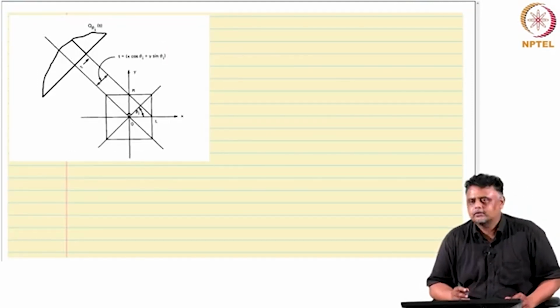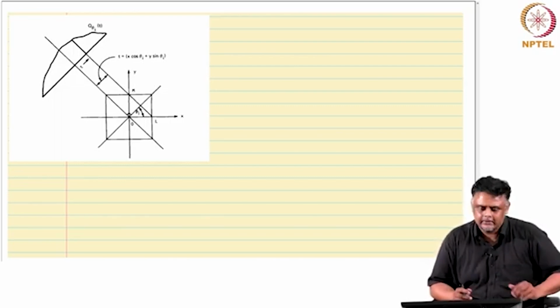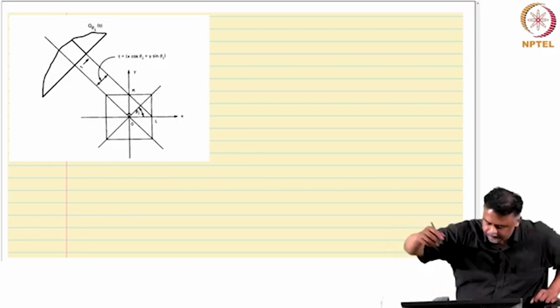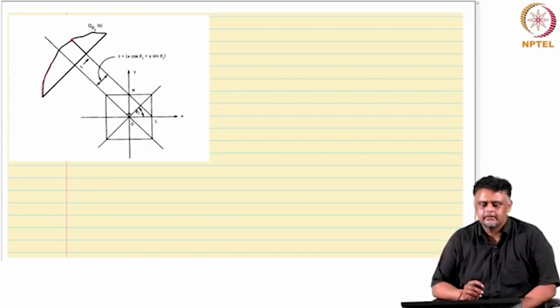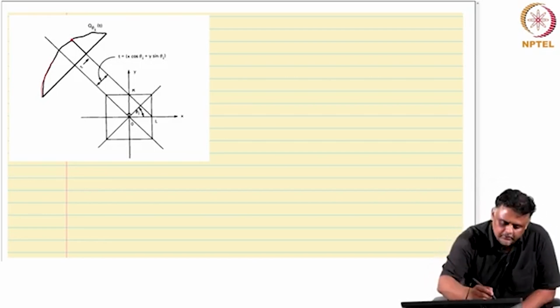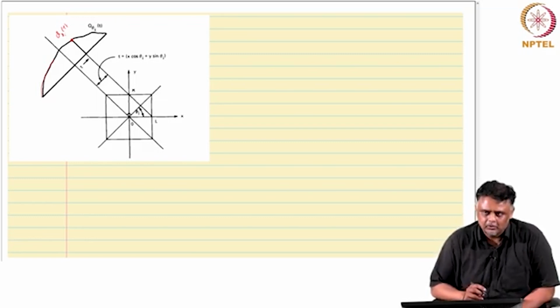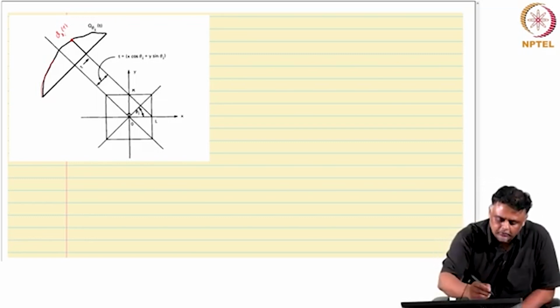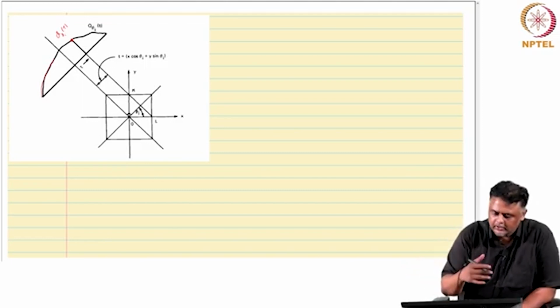So, how do you reconstruct? Very quickly, again I am not going to walk through the specifics. A very simple way of looking at it: this is the projection data right there. You take a point in the projection, some value, in this case indicated by q theta i of t. I apologize, all my theta and q look the same. I will do the pre-processing later, I will just tell you how the reconstruction is done.